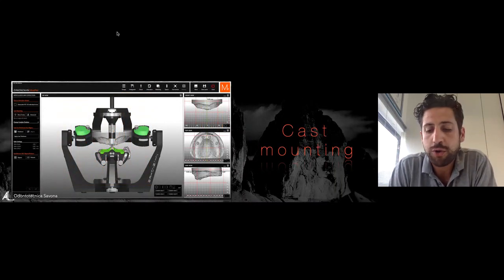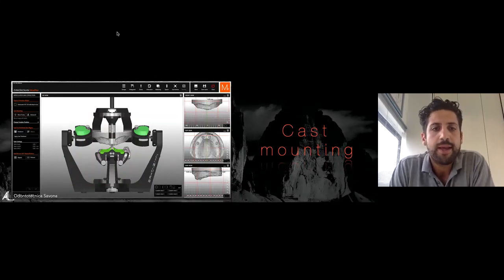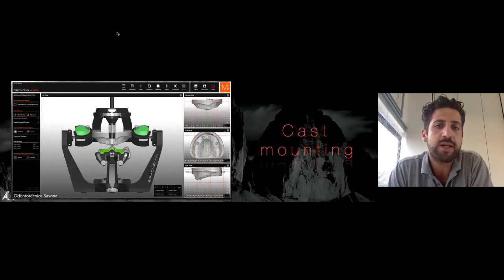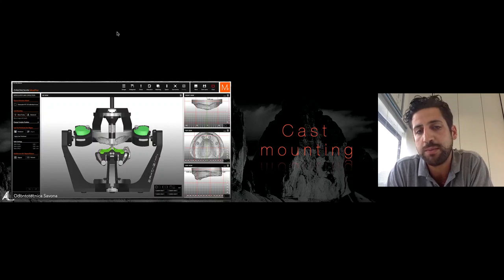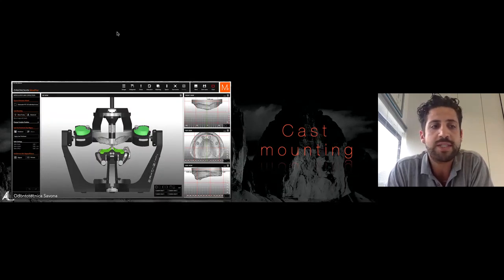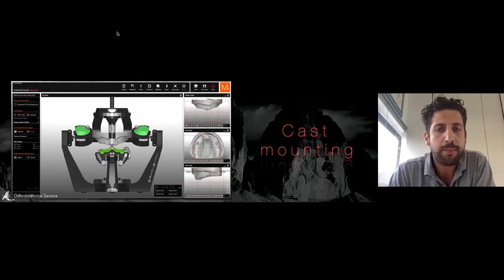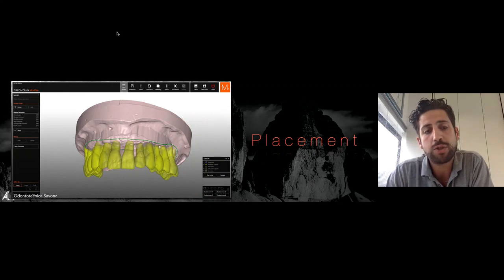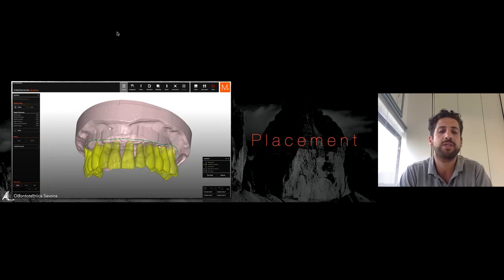And for this other case, I used this software. It's really nice to use because if you remember the last software, we had three different projects to make the final restoration. In this case, we can go inside the software and decide whatever we want to do. For example, if we want to make the virtual articulator, I make the virtual articulator and the virtual placement of the model. I start immediately with the placement of the teeth, and we can also use the teeth with the root. This is so important to get the right inclination of the axis.